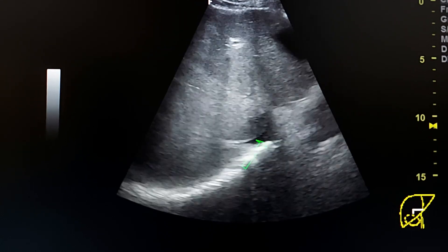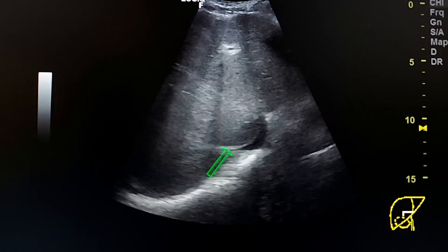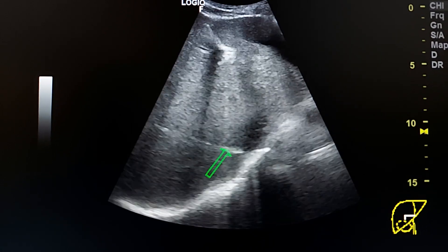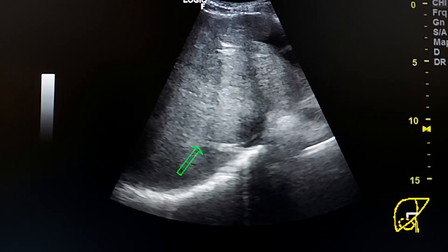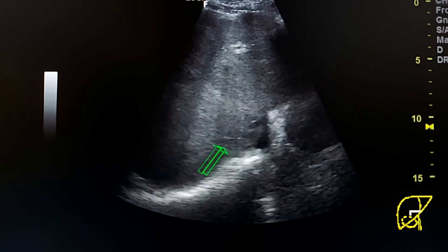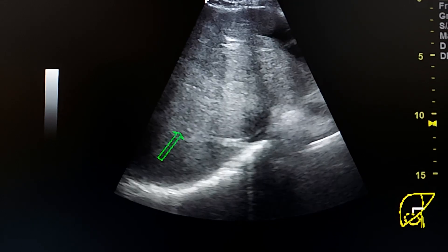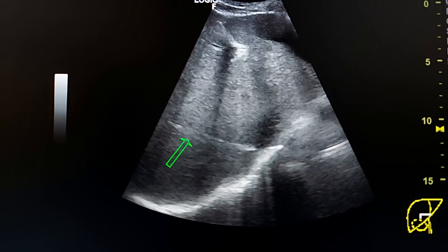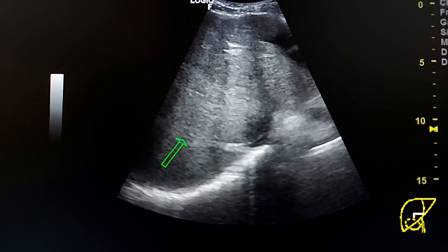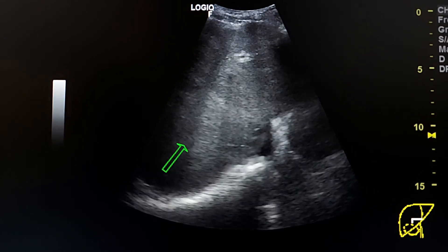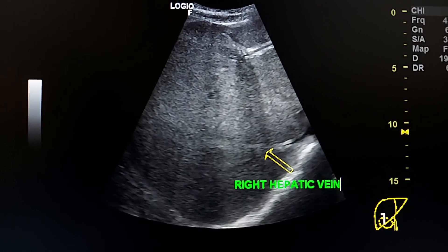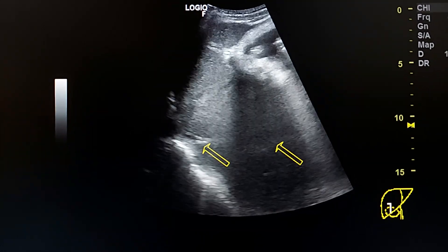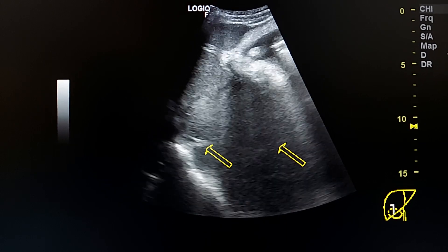Here we see the right hepatic vein, which is fibrotic and echogenic. This is a late phase of Budd-Chiari syndrome. Here is the right hepatic vein, and here we see it in sagittal section.